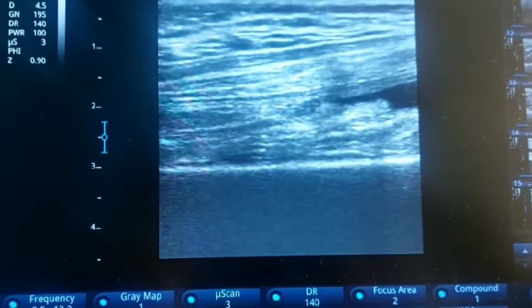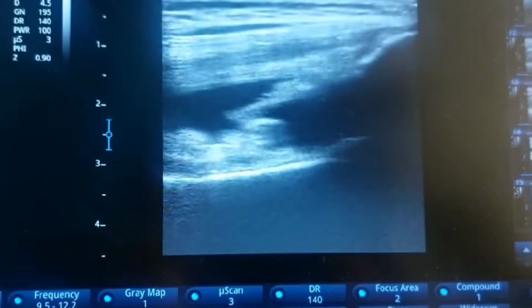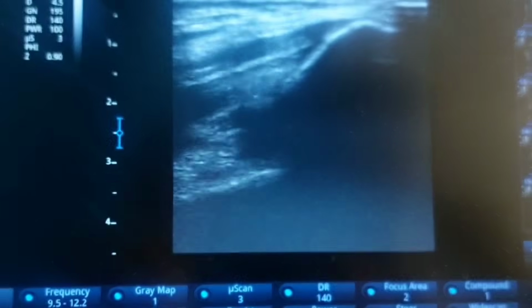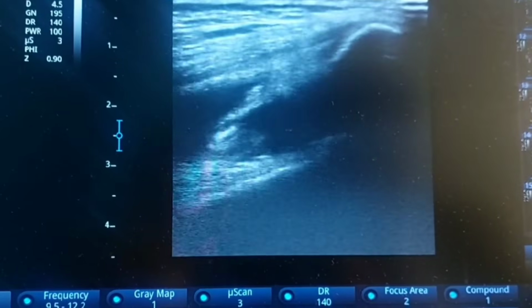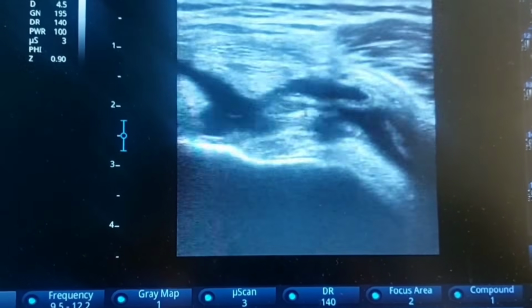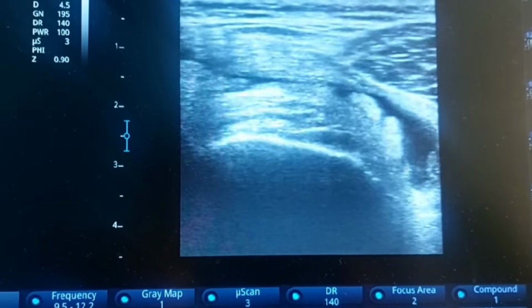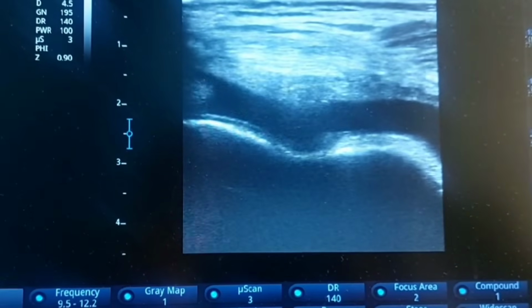As far as the quadriceps tendon and the myotendinous junction are concerned, they are okay. So far as the attachment point is concerned, there is no tear in it. So this is a classical example of suprapatellar recess effusion, and there is a variety of differentials you can write on the report.